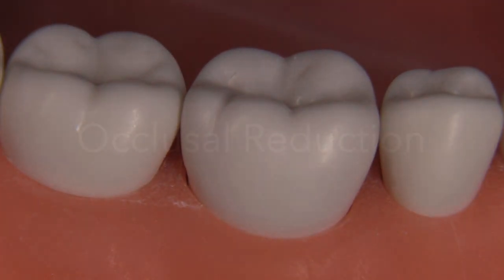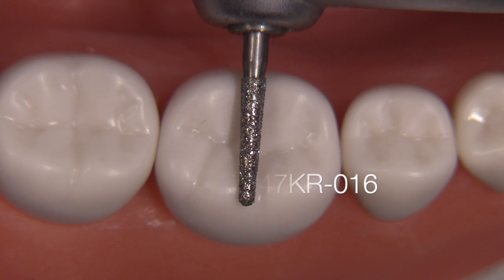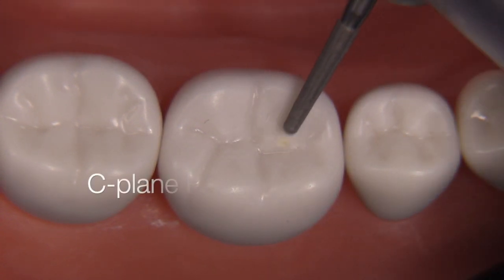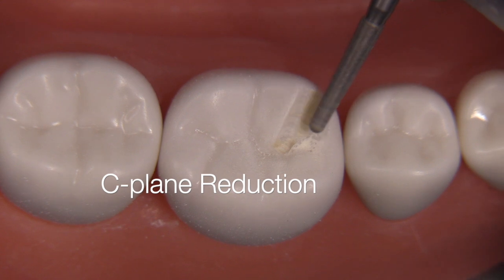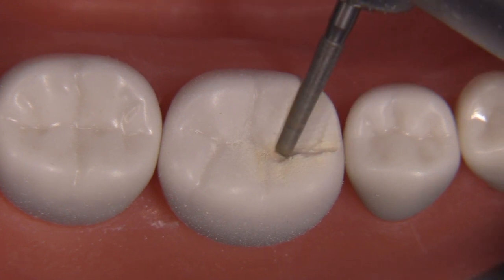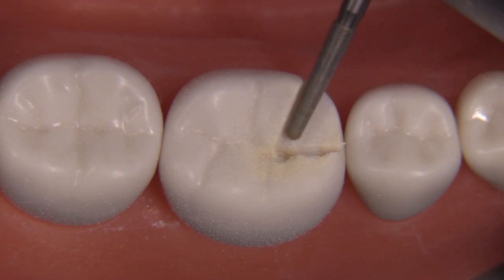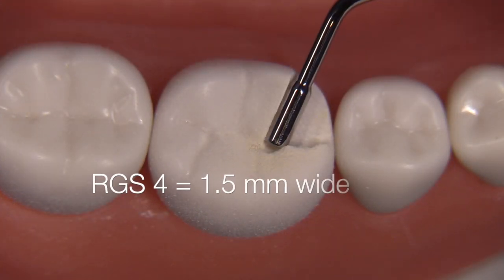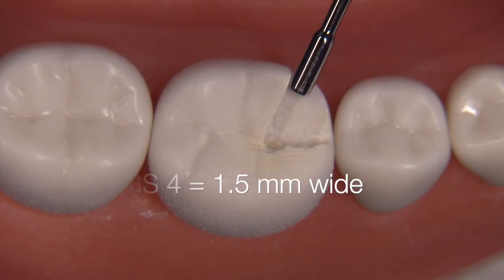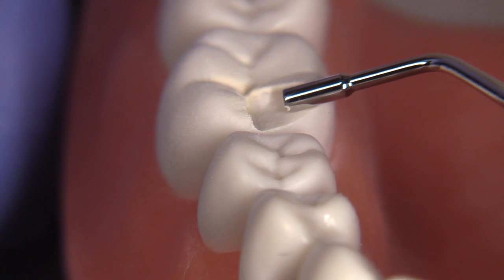Today our preparation is going to focus on a PFM where the occlusal reduction is the first step. For this we can utilize a series of different burrs — the 856016 or the 847KR 016. Start off with the C plane and use the burr to your advantage, understanding that the thickness of this diamond is 1.6 millimeters at its widest area; the tip measures 1.1 millimeters. I'm using the RGS4 as a guide, which is 1.5 millimeters wide.